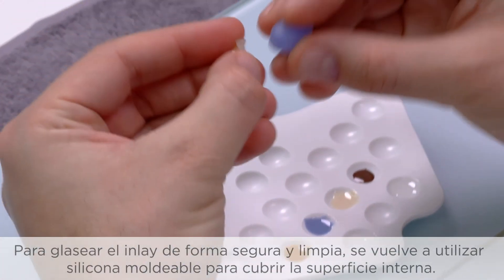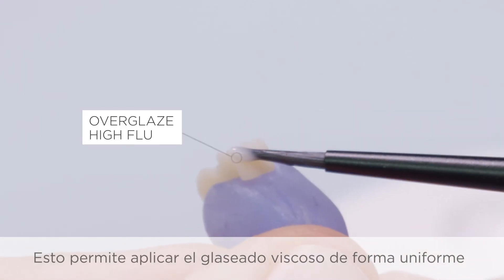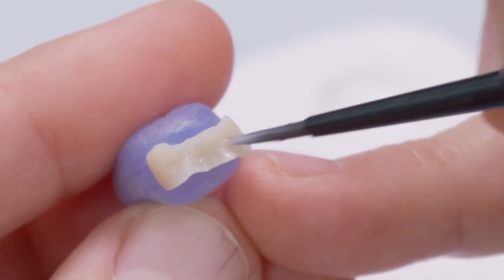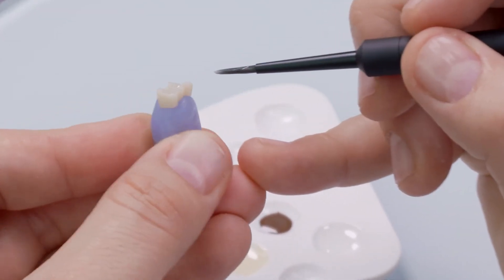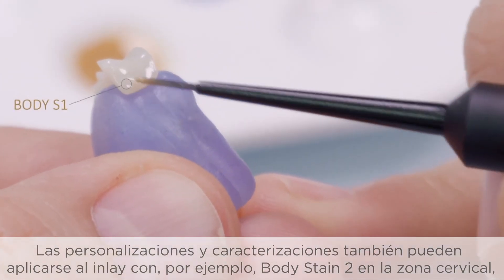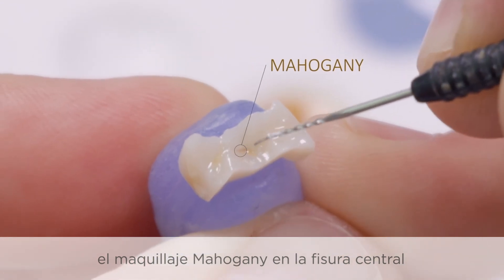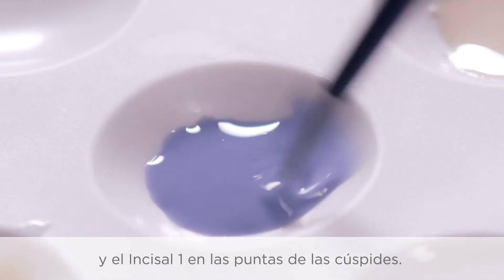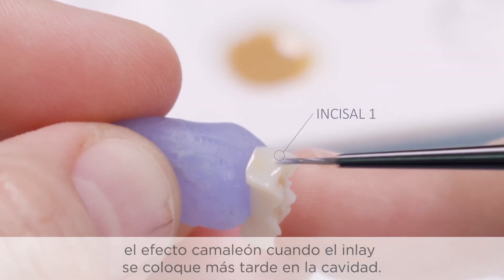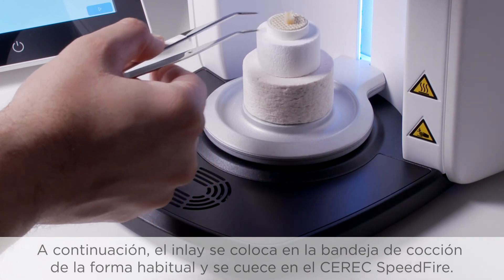For safe and clean glazing of the inlay, the moldable silicone is again used to cover the inner surface of the inlay. This allows the viscous glazing material to be applied evenly without touching the important inlay margins and affecting the fit. Individualizations and characterizations can also be applied to the inlay with, for example, body stain 1 in the cervical area, stain mahogany in the central fissure, and stain incisal 1 on cusp tips. This can also contribute to an optimum adaptation and a chameleon effect when the inlay is later placed in the cavity. The inlay is then placed on the firing tray in the usual manner and fired in the Seric Speedfire.